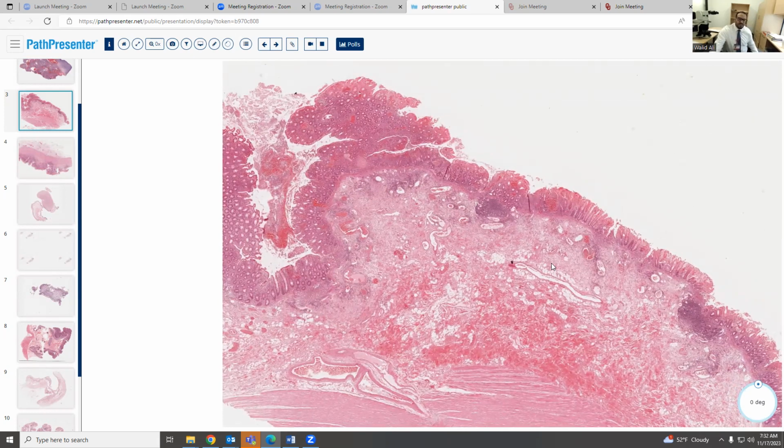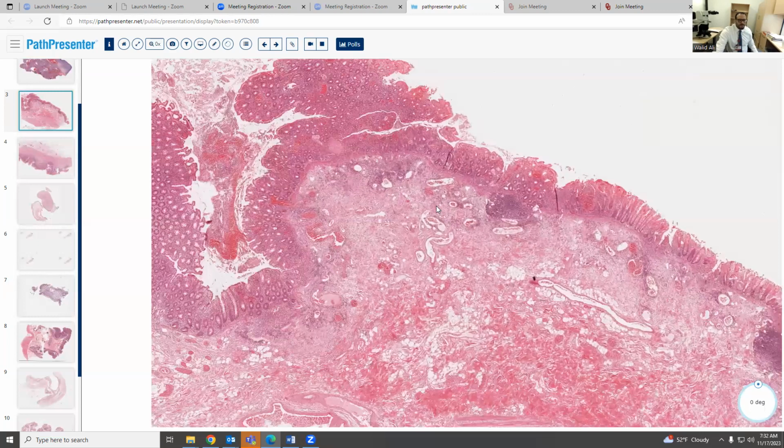In Crohn's disease with skip lesions, we can see a distorted area, and then we see normal area, and then we see again unhealthy epithelium. So these are features, and other things. Crohn's can happen anywhere from the mouth until the anus, but ulcerative colitis is usually in the rectum or the colon.